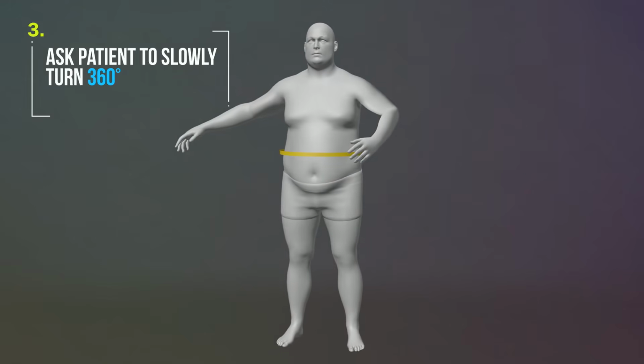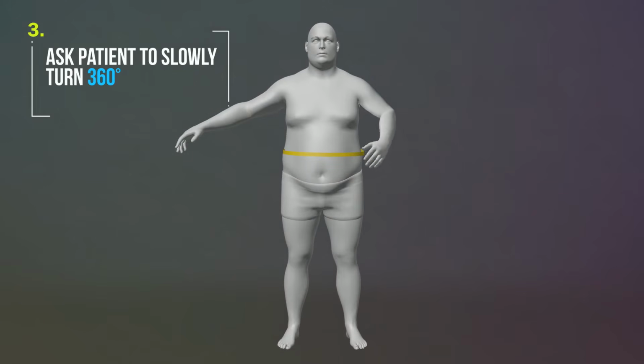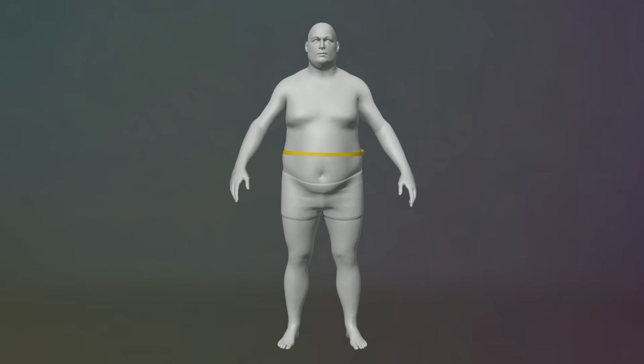Once they have turned 360 degrees, ask them to release the tape to you and relax their arms at their side. Ensure that the tape measure is parallel to the ground. The tape measure should be snug but should not compress the skin.